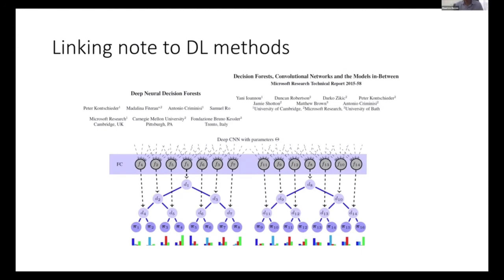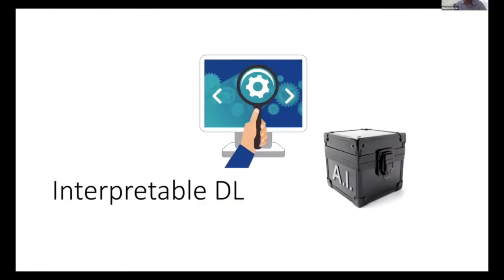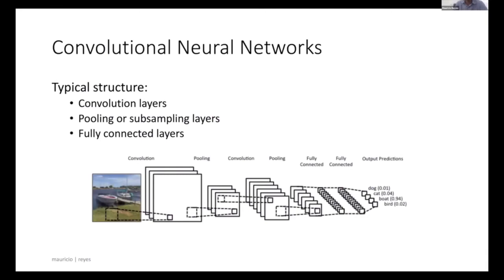Now, with deep learning, we have this very complex system. So how can we actually open the black box and try to understand them? I'm going to go through some of the approaches and attempts to do this. So first of all, some of the basics, right? We are going to focus on convolutional neural networks. As we probably saw, the aim of doing convolutions is to try to convey information from a patch into a very reduced set of information.